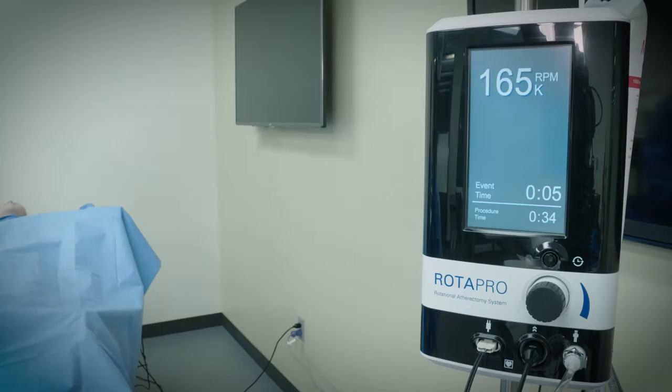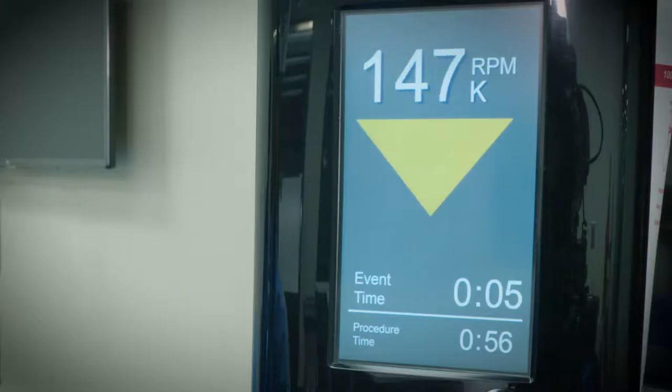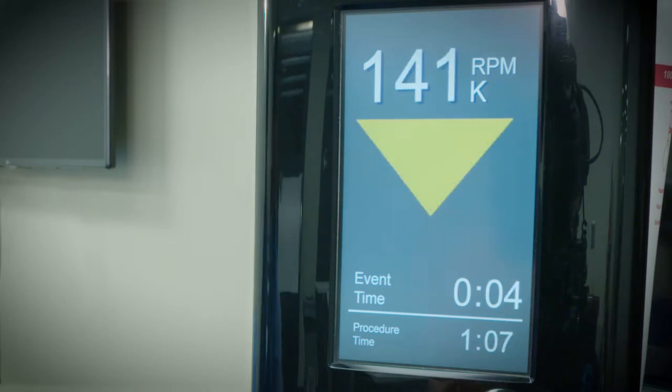While rotating, a yellow triangular outline will appear when rotational speed drops more than 5,000 RPM below the free lumen platform speed. A solid yellow triangle will appear when rotational speed drops more than 10,000 RPM below the free lumen platform speed.